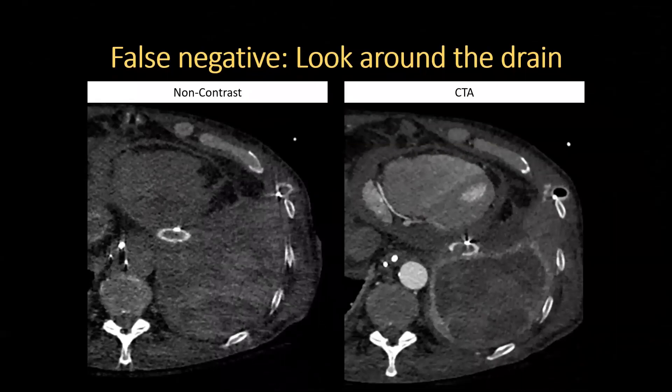Iatrogenic bleeds are quite common, so I pay attention to the course or tract of a recently placed line or tube. This was a 66-year-old man with hyperattenuating left pleural fluid noted on recent chest CT following chest tube placement. No bleed was identified initially. On closer inspection, however, a focus of extravasated contrast is seen along the course of the chest tube as it crosses the intercostal space, likely due to an intercostal artery injury.